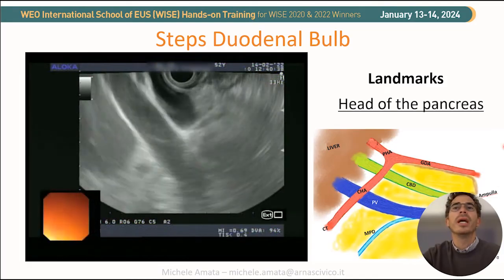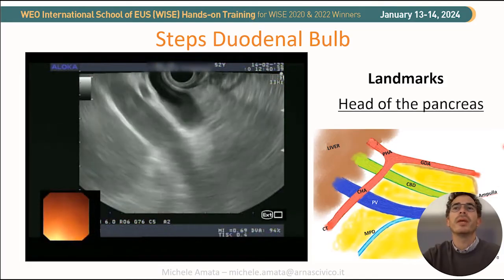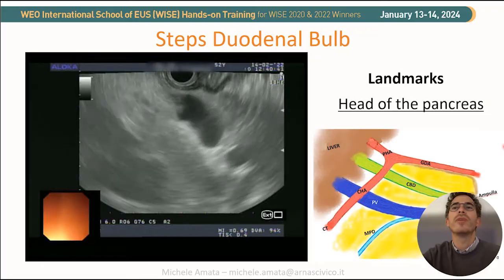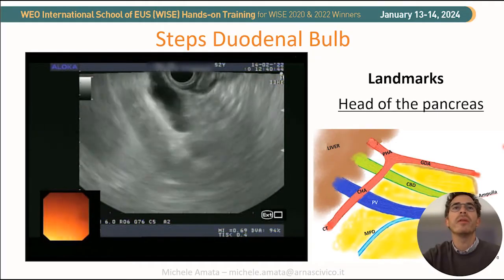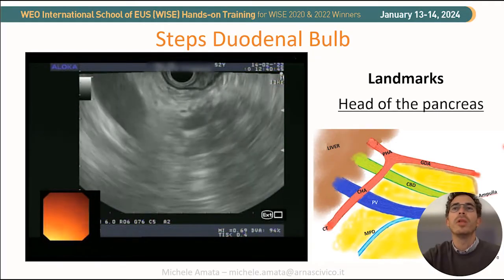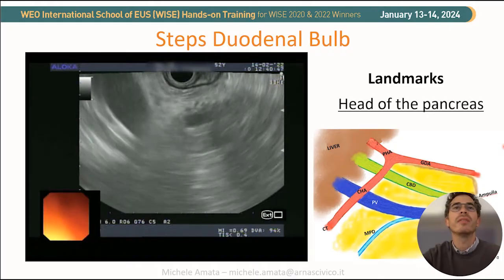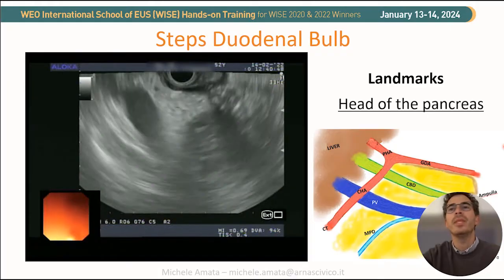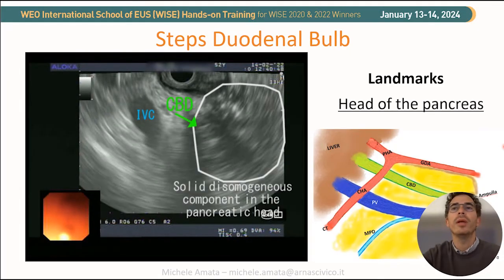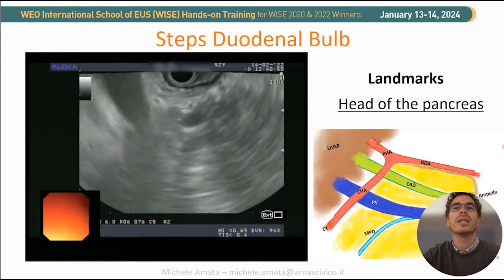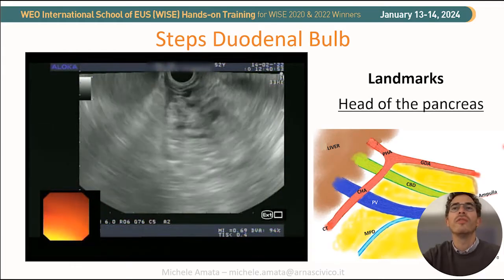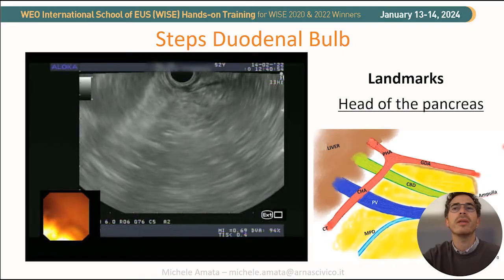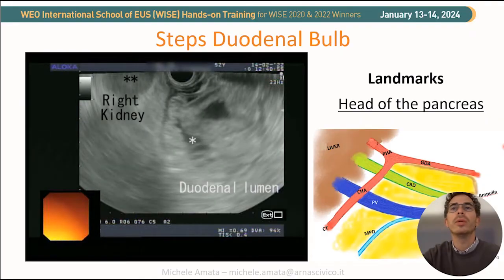Again by torquing clockwise, we trace the CBD from the hilum to the head of the pancreas. Below the CBD, we can trace the MPD moving to the ampulla. In this clinical case, we detect a solid dishomogeneous lesion of the head of the pancreas and a cystic component in the groove area.